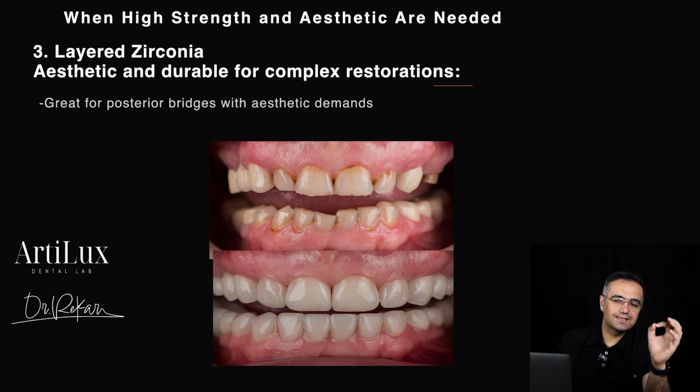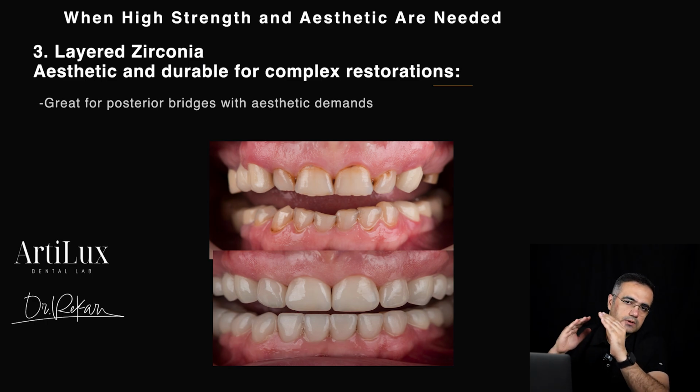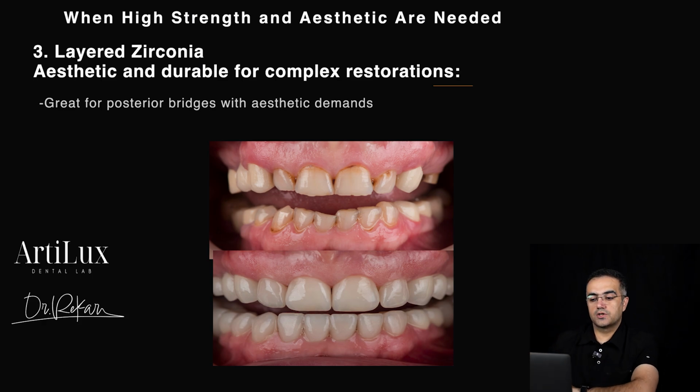And if you need the aesthetic, it should be with facial layering or sometimes even occlusal layering. But I personally recommend just doing the facial layering because it is much easier for the designer to control the contacts. If there is a good scan of the prepared tooth and a good bite, then I prefer to do only facially layered zirconium oxide bridges. As you can see in this case, we did the bridges with facial layered zirconium oxide.